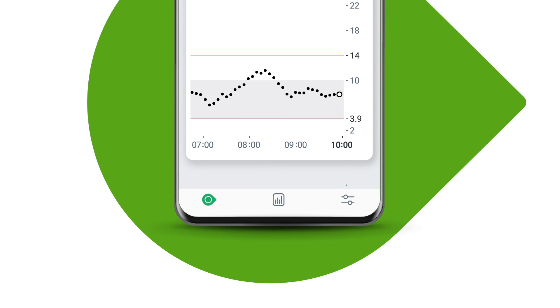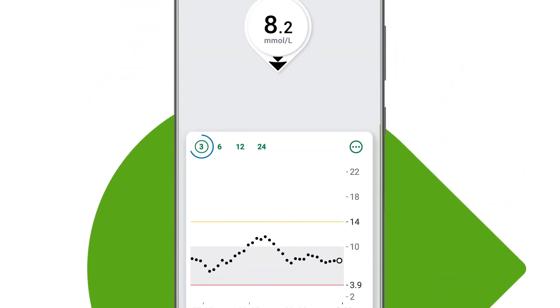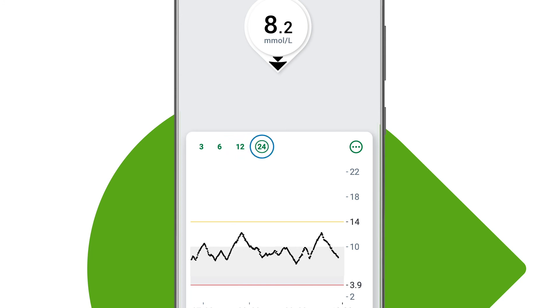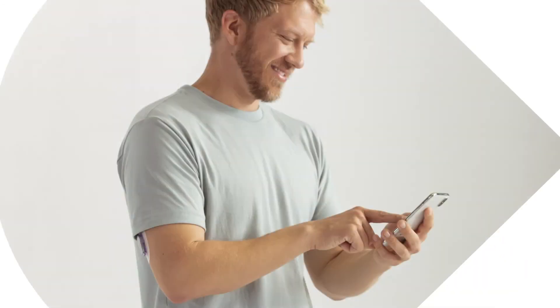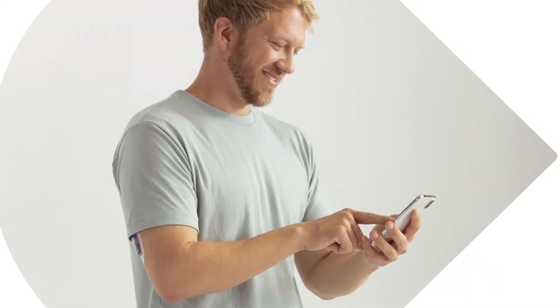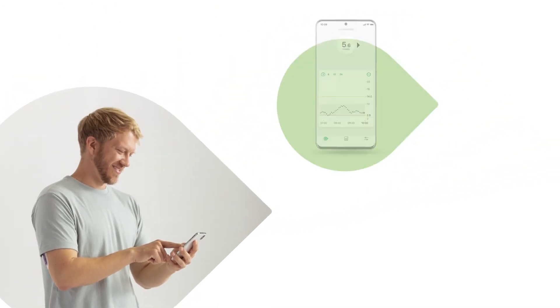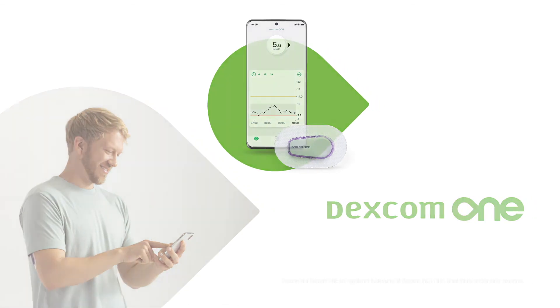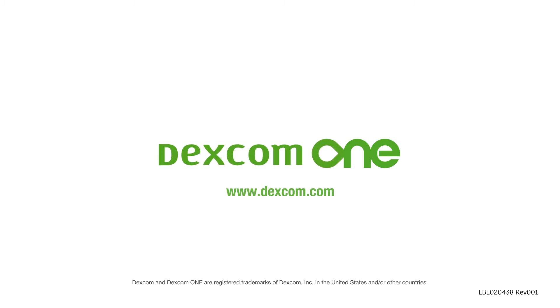You can change your graph to show you the past 3, 6, 12 or 24 hours. These are the core elements of the Dexcom One app that will help you in controlling your diabetes.